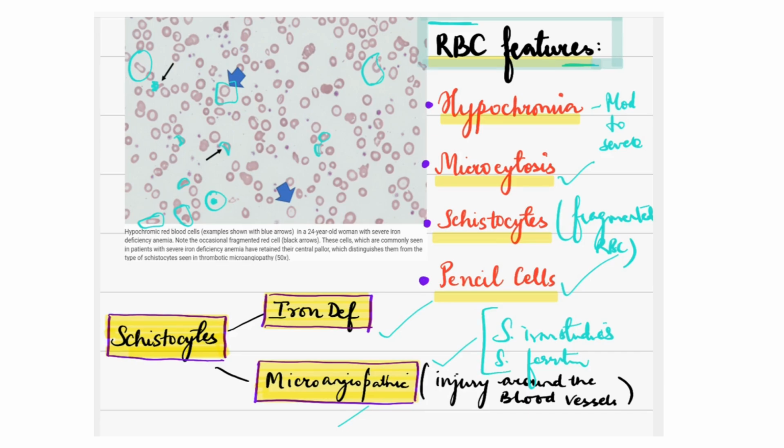And this is how we approach a case when we see a peripheral smear. Do not jump to a diagnosis, I am again saying, because that's not necessary. What are the findings you are jotting down? That's what is important, because once you jot down everything you see under the microscope, your diagnosis will be screaming. So just take care of the size and the shape and the abnormal cells, and the diagnosis is not far.